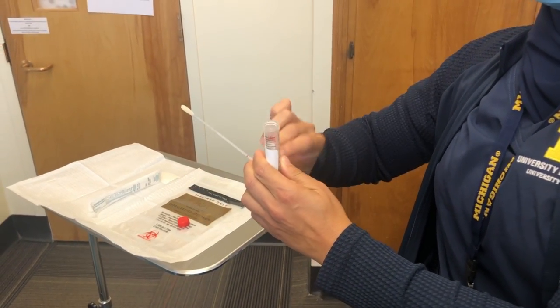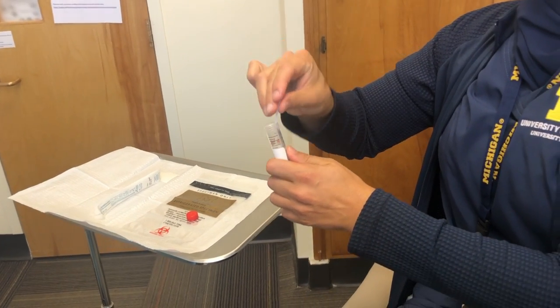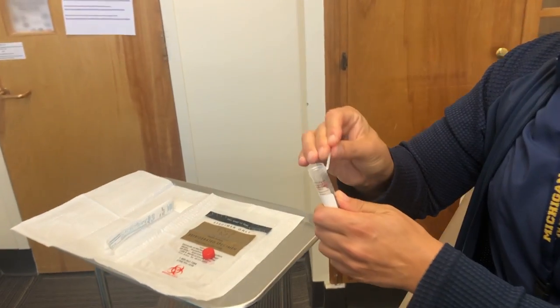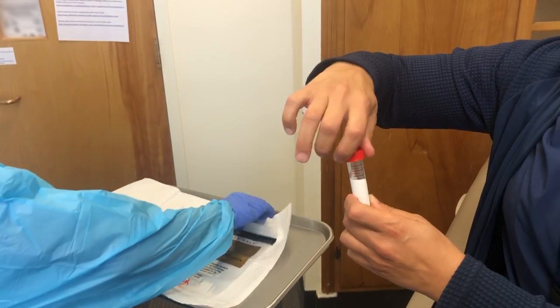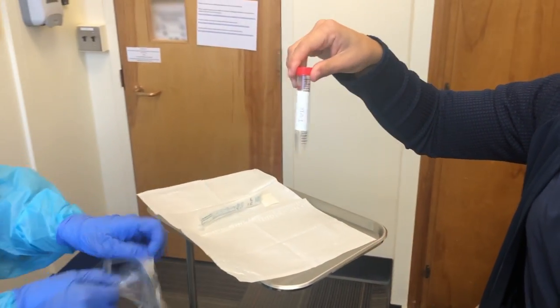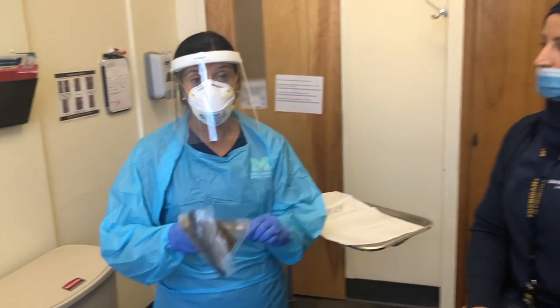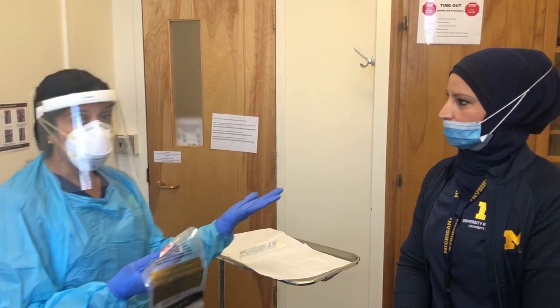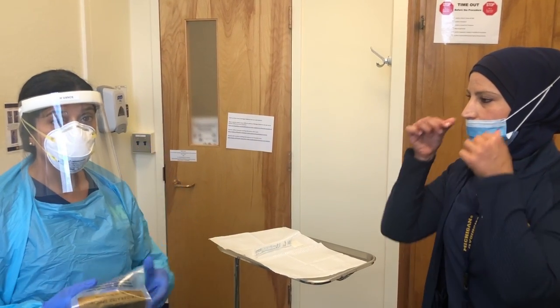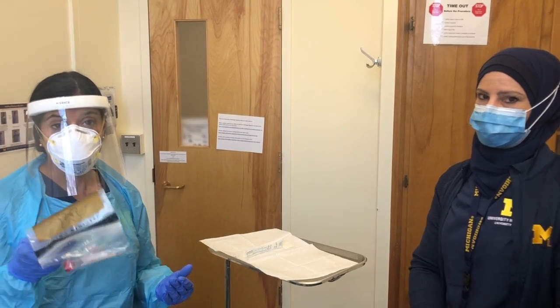You're going to put your swab in, making sure the tip contacts the liquid in the bottom. You're going to break at the perforation mark. You can discard that piece, put your cap on your tube, make sure it's secured tightly, and go ahead and drop it in the bag. So I'm going to confirm that this is tightly secured, that it's labeled with the right person and ID. I'm going to ask Layla to make sure she puts her mask back over her nose, and I'm going to have her hand sanitize before we turn her specimen in, which she has right over here.